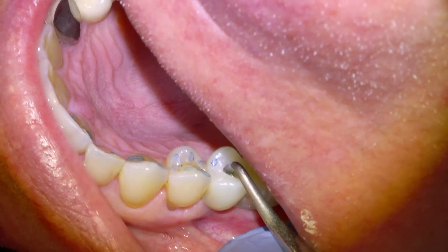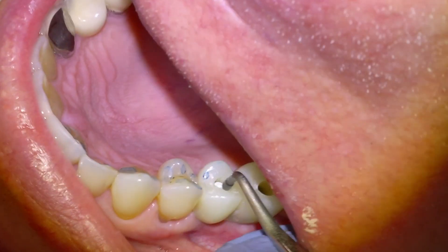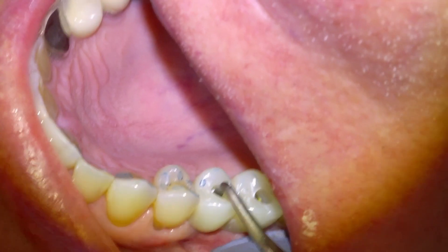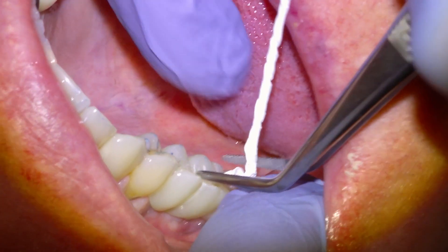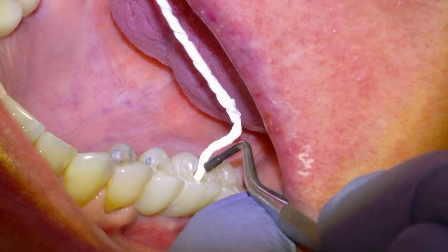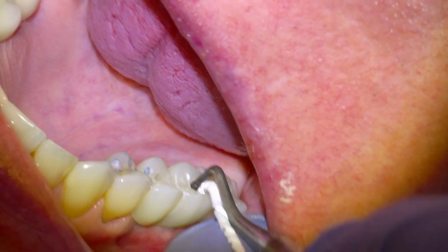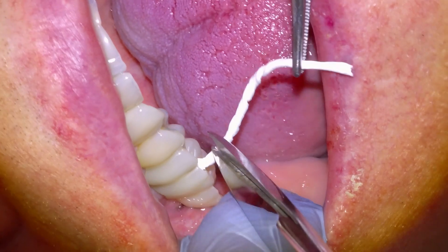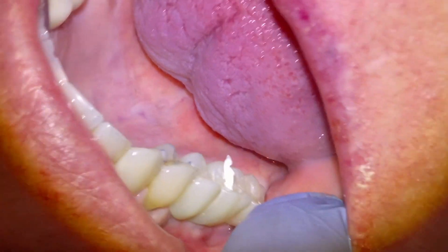This is actually a procedure we're usually able to do without freezing. The type of implant we use — this tissue level implant — is usually pretty forgiving and we don't even need to freeze. The patient will feel it compress the gum tissue but it's not really a painful process. Even placing dental implants is not usually as bad as having a tooth out with proper freezing.